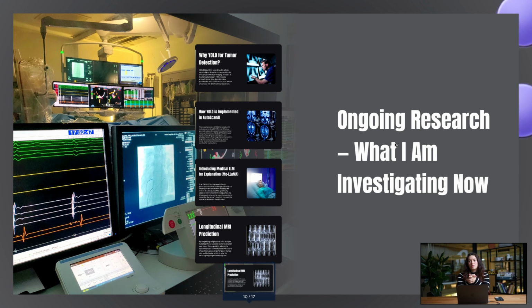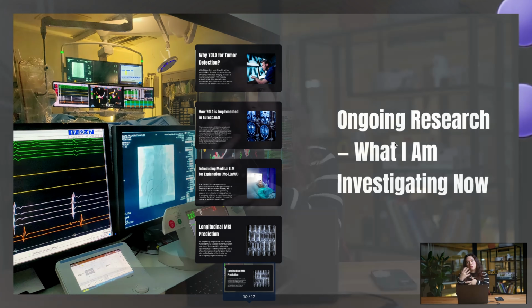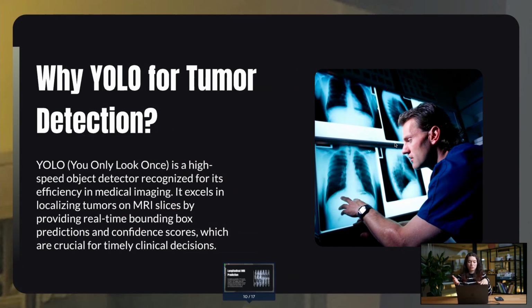Other than this, I've been doing a lot of research and learning things to implement in the future. One of those was YOLO, which is You Only Look Once. It's basically an object detector that recognizes objects and puts them in a bounding box, and then it gives you class and confidence. You might ask what I have been doing all this time, if it's not that. It's actually this, but I also wanted to implement something else to make it stronger.